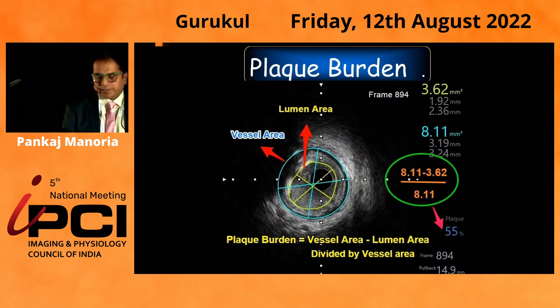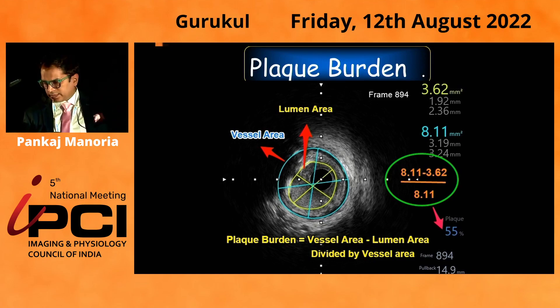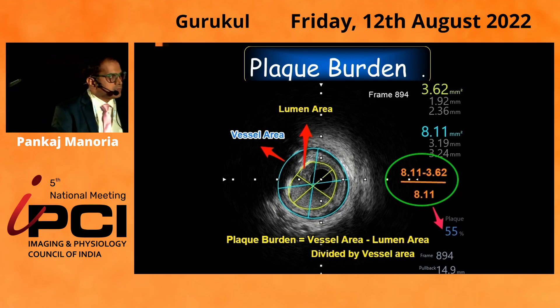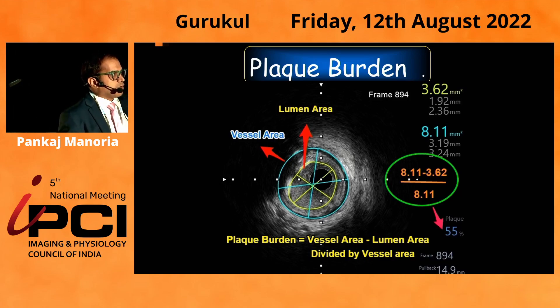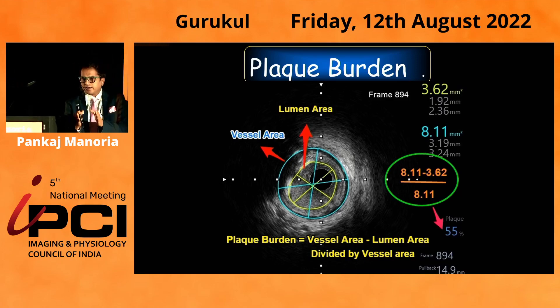There is something called the plaque burden. The plaque burden is how much of the vessel area the plaque is occupying. It can be easily measured: you subtract the lumen area from the vessel area — it gives you the plaque — and once you divide it by the vessel area, it gives you the plaque burden. In this case, the vessel area was around 8.1 and the MLA was around 3.62.